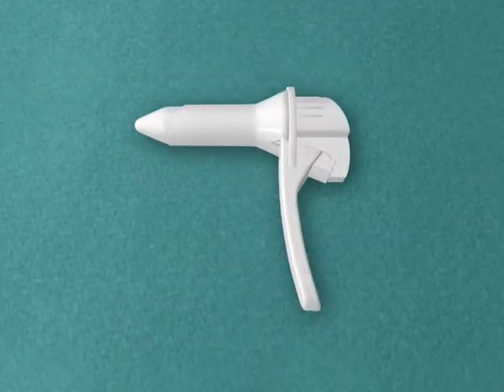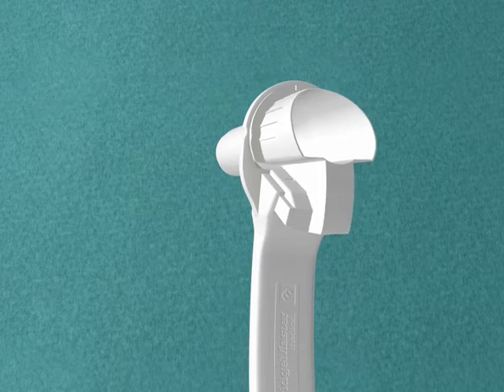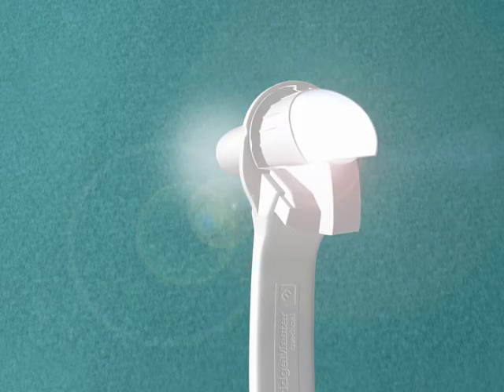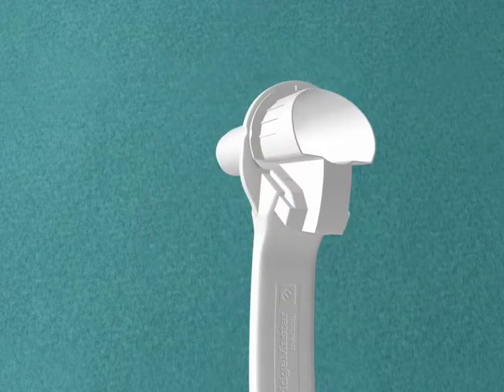Ensure the light is working. To do this, rotate the obturator anti-clockwise until it clicks or visually unlocks. The light will switch on automatically. Lock the obturator back into place by rotating it clockwise until it clicks or visually locks.